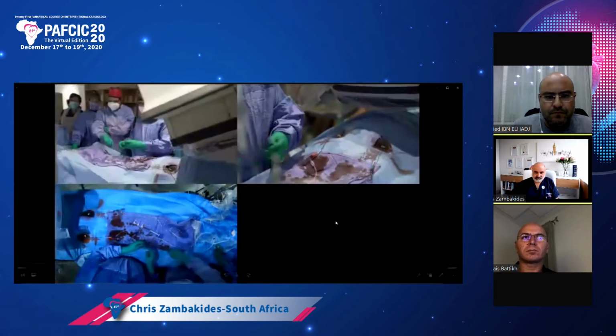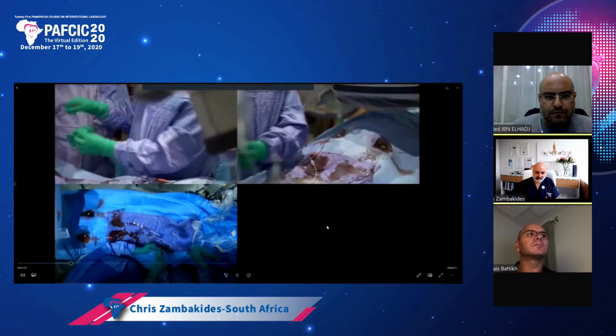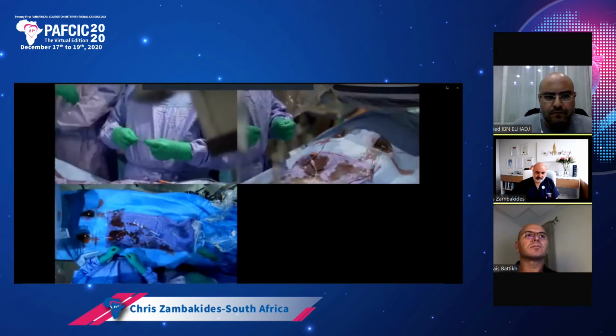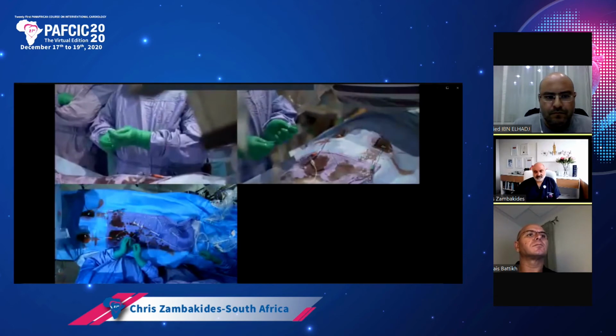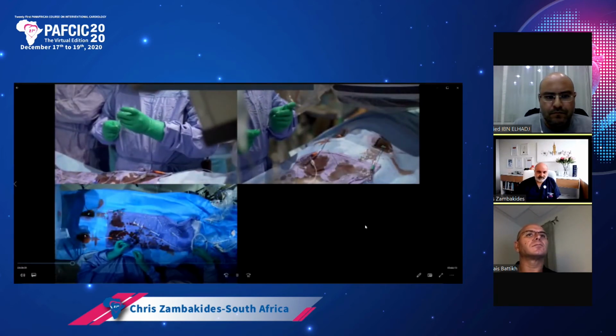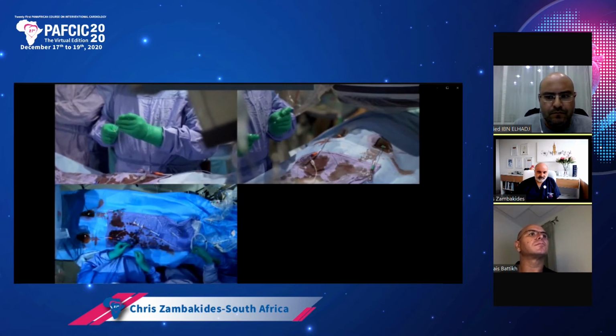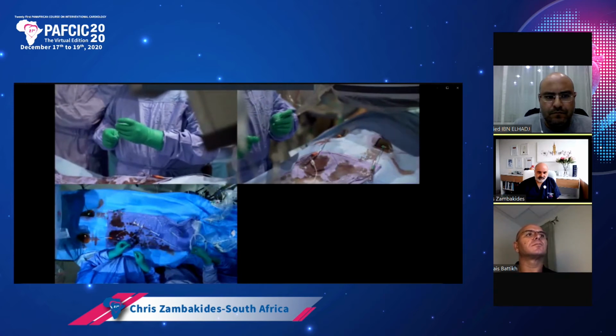Give me the Sion Black. So to get into the LAD, you can use any wire, but to try and save on wires, my workhorse wire anyway is usually the Sion Black, and I'll show you now.